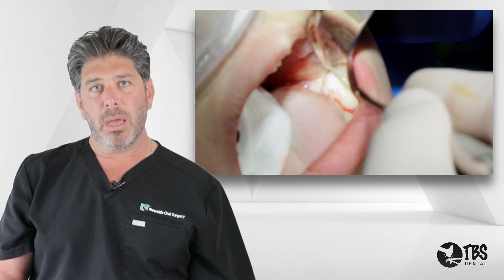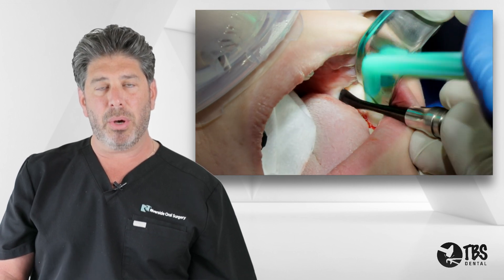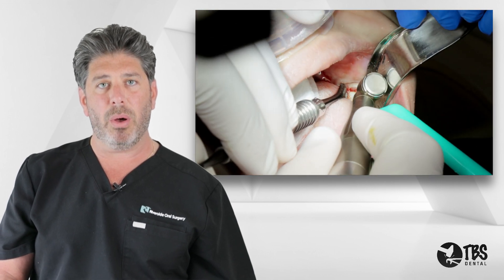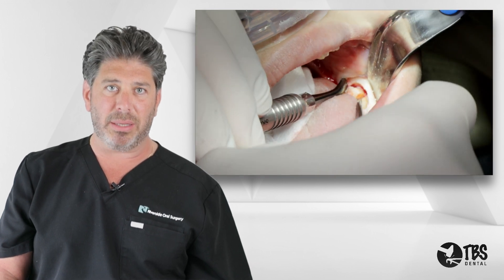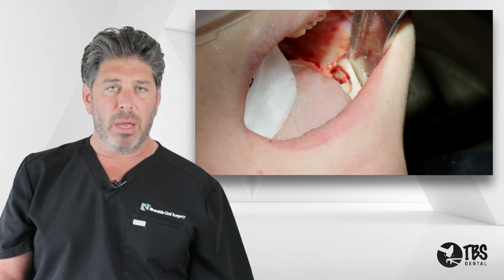On the lower, we elevate the soft tissue flap on the buccal, protect the lingual flap using the wide end of the periosteal elevator, trough the bone using the Lindemann bur on a rear-exhausted high-speed handpiece, and then using a 301 elevator we enter the socket at the mesial aspect of the third molar, using some distal rotation to lightly remove the tooth.